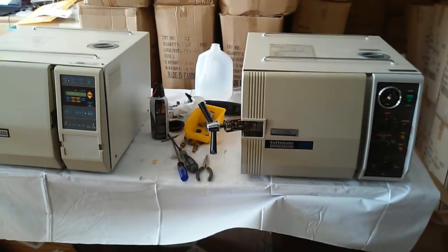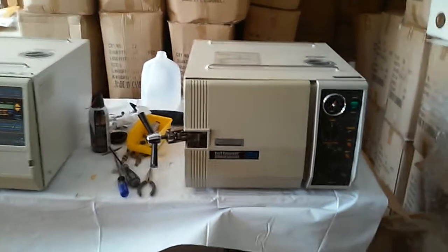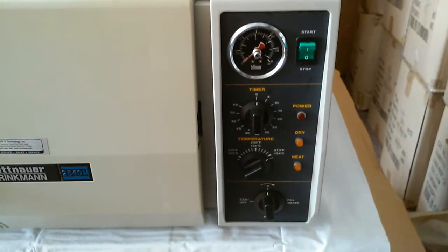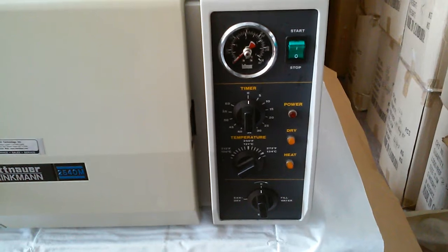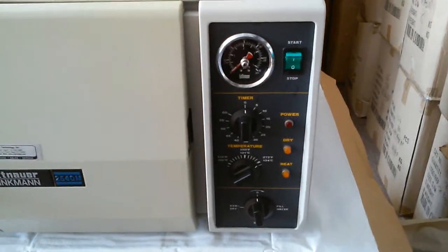From the front side, you see on the right of the front side — that's the control panel. This is a manual sterilizer. You will see the temperature knob and the timer knob. On the bottom is a multiple-function valve. On the top is a gauge — that's a pressure gauge.